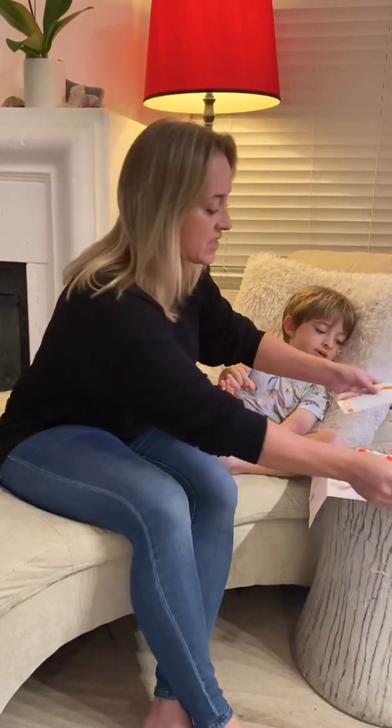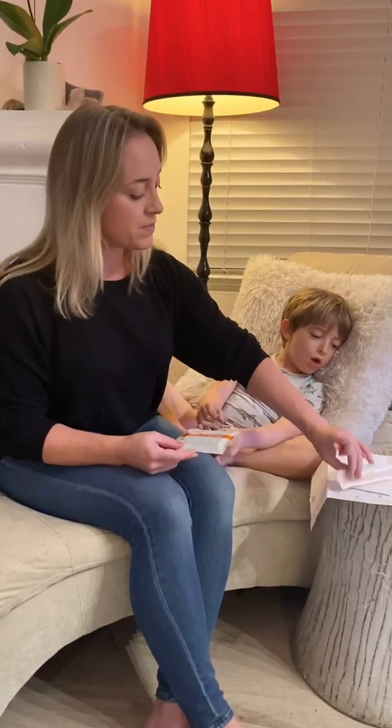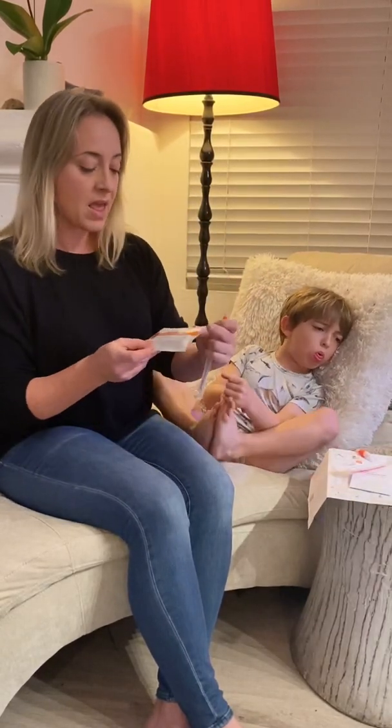Here we have two tests and we're just going to run one for him today. So you have your tube, your swab, and your test card.